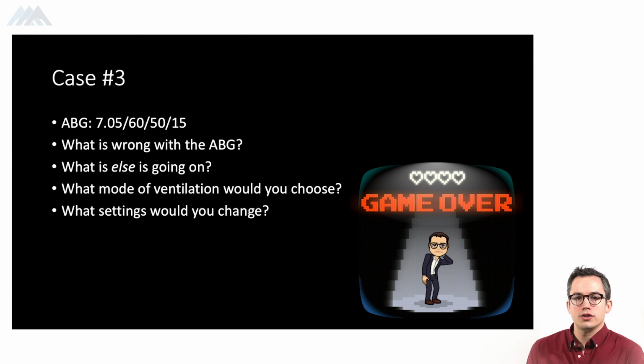We're going to make sure that our FiO2 starts out at 100. Our PEEP is going to be a little bit higher than 10 to make sure our alveolar units are open. We're going to increase that respiratory rate. And we're also going to make sure that as we increase our respiratory rate, that we still initially though start at that lung protective strategy of having that 6 mLs per kg.